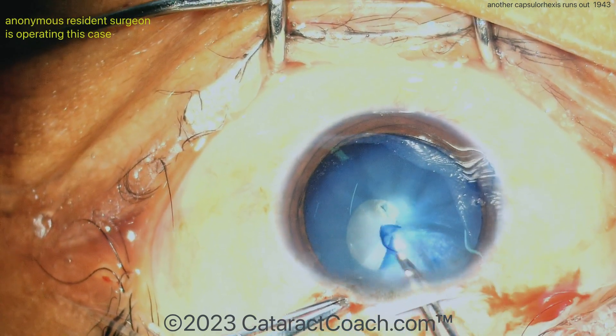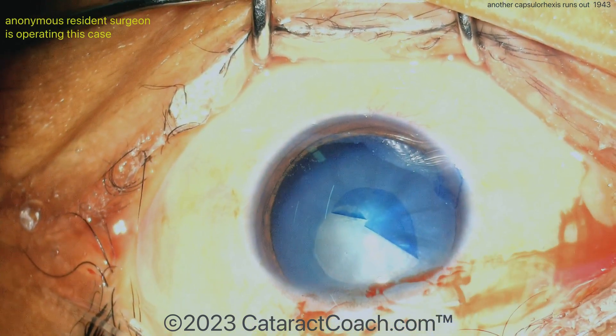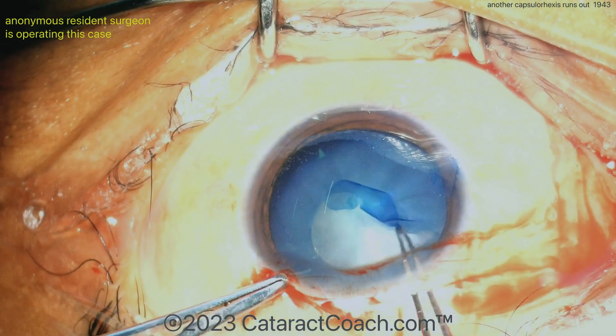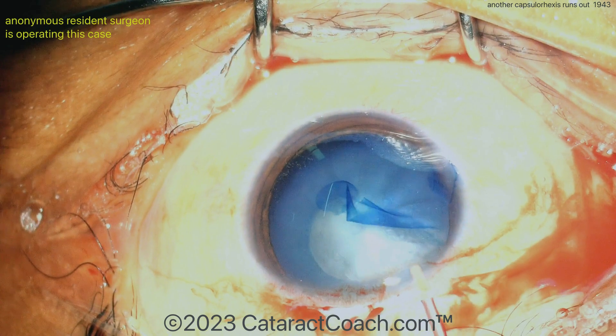Starting the rhexis here — watch carefully, what's going to happen? There it is, so far so good. Try and grab it again — and now it's already out. It's already ran out to the edge of support. It's going to make it very difficult to continue.